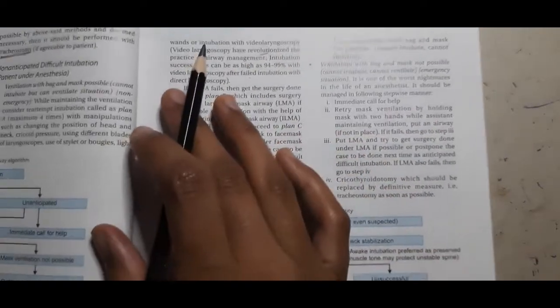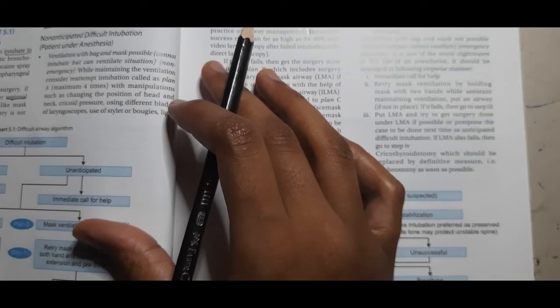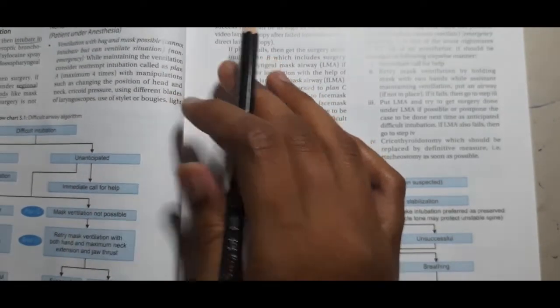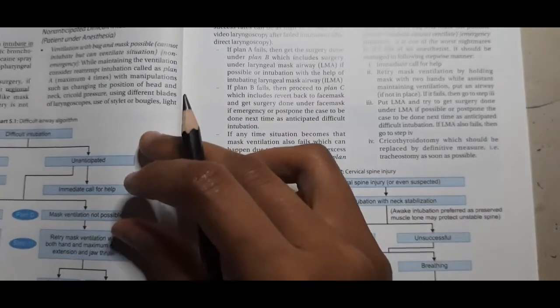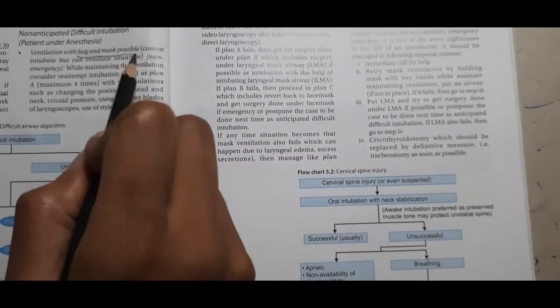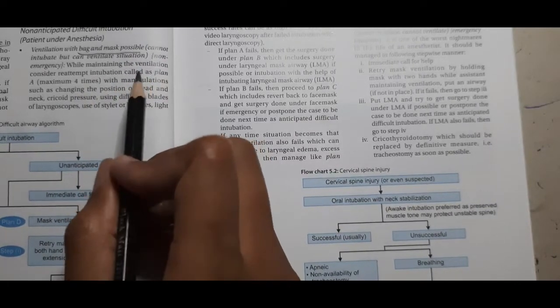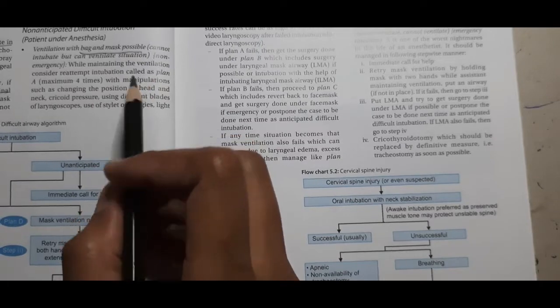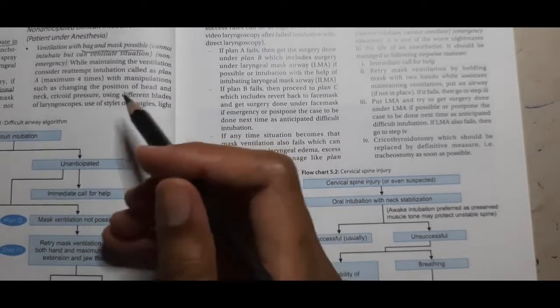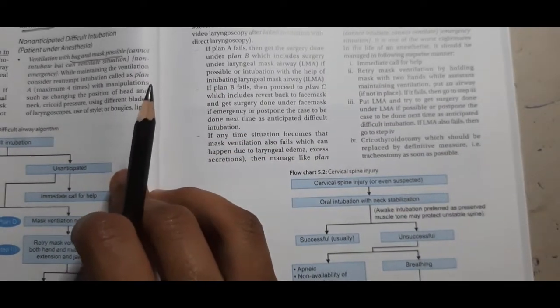So in non anticipated difficult intubation, you might not have anticipated the difficulty. In this case the patient is under anesthesia, and you can go with ventilation with bag and mask as much as possible. If the ventilation is good and fine, you can reattempt the intubation as plan A. So plan A should always be reattempting intubation after bag and mask ventilation.